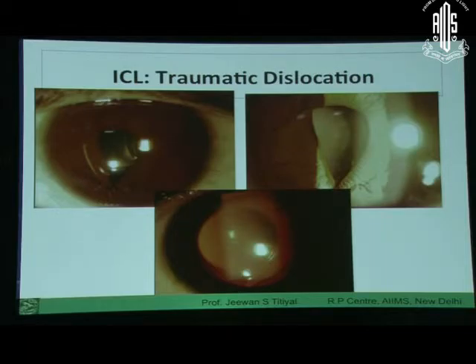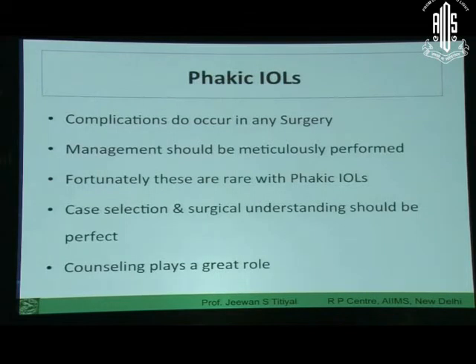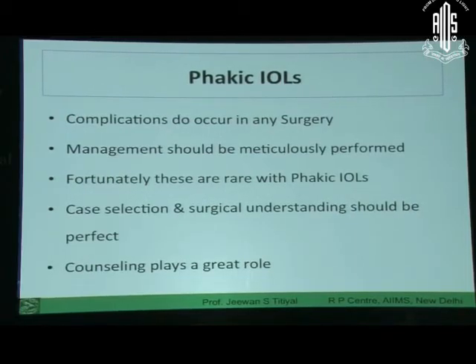Dislocation of ICL can also happen. This is one of my patients with an injury to the face, and the ICL haptic came off. So this can also happen with ICL, not with Verisyse only. So I would say complications do occur in any surgery, especially intraocular surgery. It's true for our phakic lenses also, but fortunately they are very, very rare, and if managed properly, intraoperatively and postoperatively, and especially with a better examination and parameter finding of these patients, you can still do a very good job in these patients. Thank you for your kind listening.